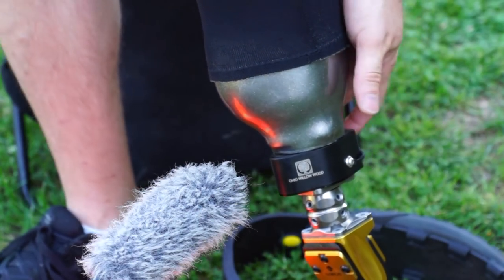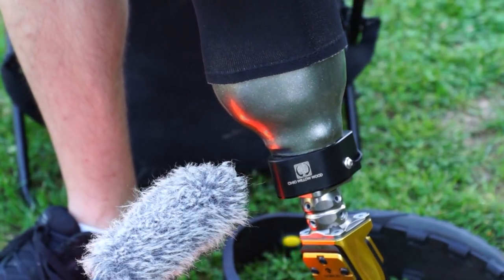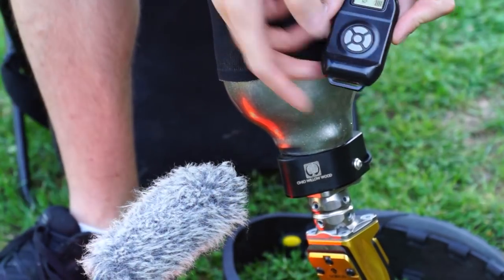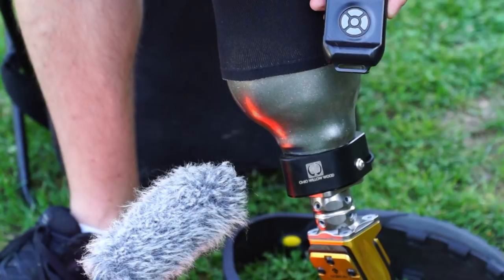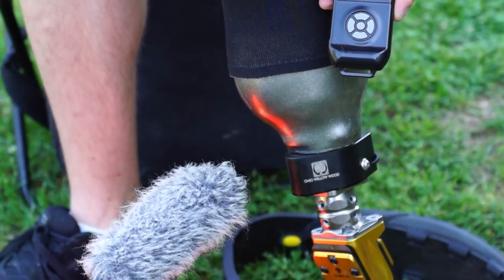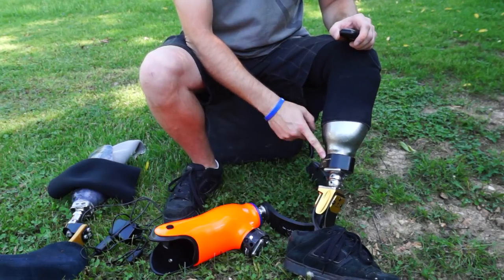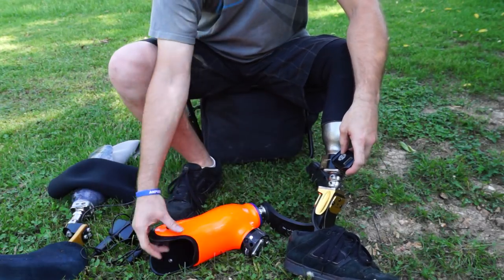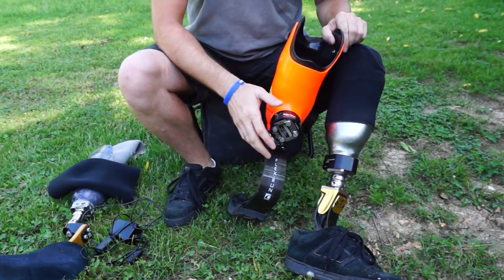Once you are all the way on, there's a button on the back of this particular pump that you press, then use your key fob to turn the pump on. Right now it's sucking out all of the air inside the socket between the urethane liner and the flexible inner liner. My type of pump is Limb Logic — this is the first generation Limb Logic with this key fob. On my running leg I have the latest generation Limb Logic; it's a slightly different shape and they've made some improvements.